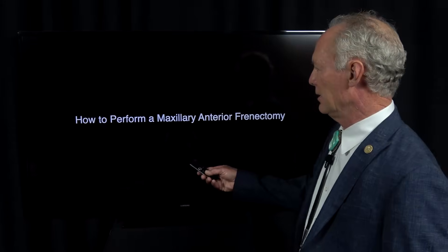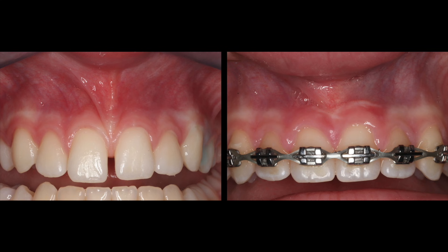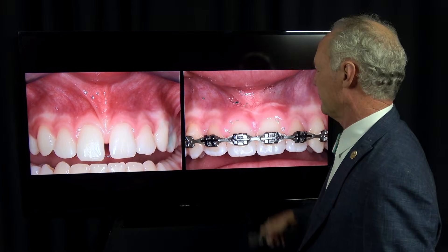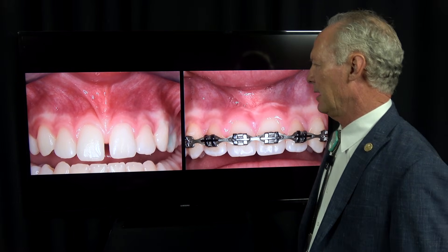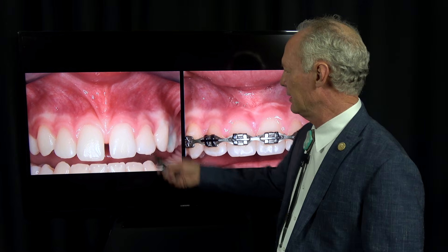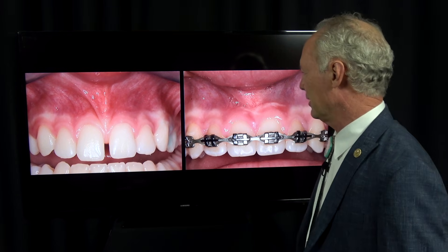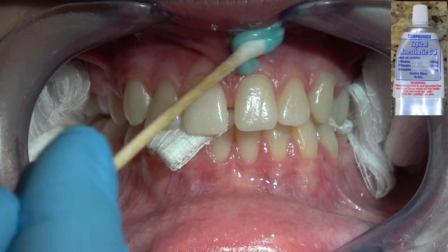Hello. Let's talk about how to perform a maxillary anterior frenectomy. Here's the frenum and here's the post-op. There's a specific way to perform a maxillary anterior frenectomy or any frenectomy. I was in an oral surgery fellowship at Baylor Dental School for two years, and this is the frenectomy that I was taught by Dr. Cosentino, who was an instructor in the oral surgery department.